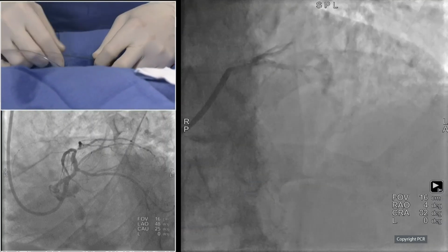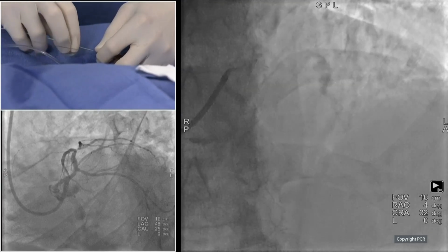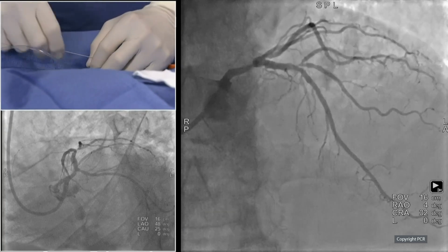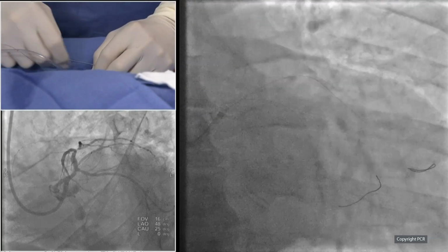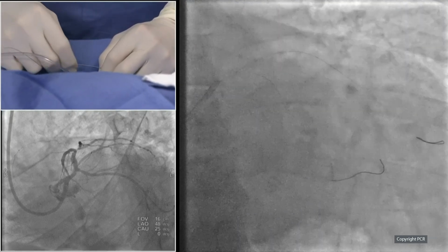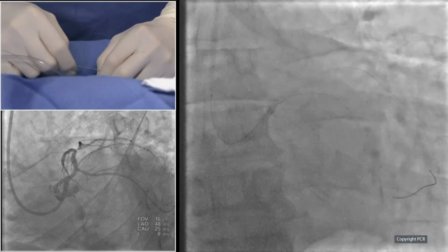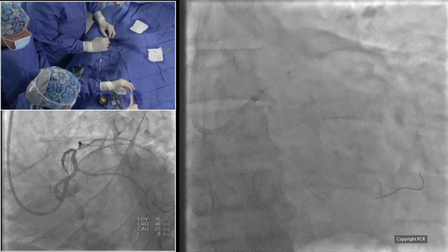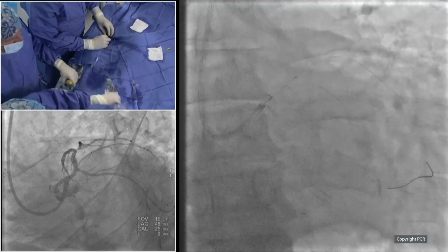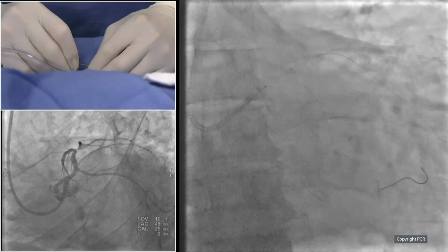Yes, the multi-slice CT scan is very reliable if there is no disease. You saw the origin of the main stem, 16 millimeter square. When you have a lot of calcium, there is what we call the blooming effect, and then you may have some underestimation of the vessel area and overestimation of the narrowing. So you have to take that into account.